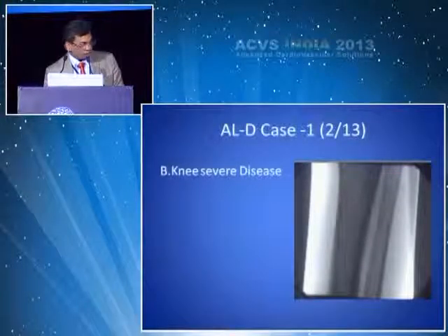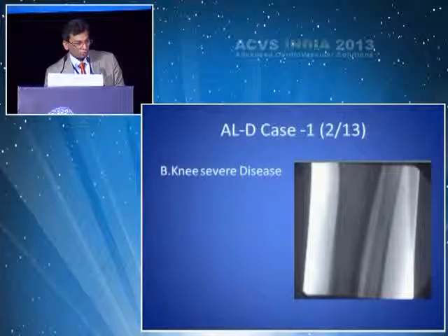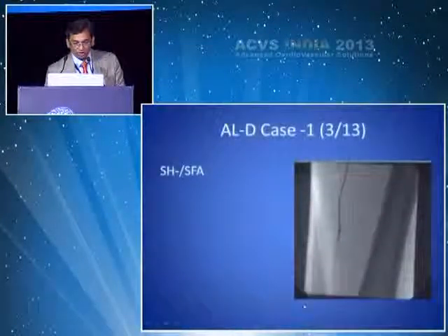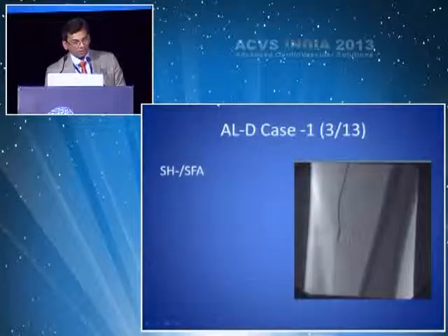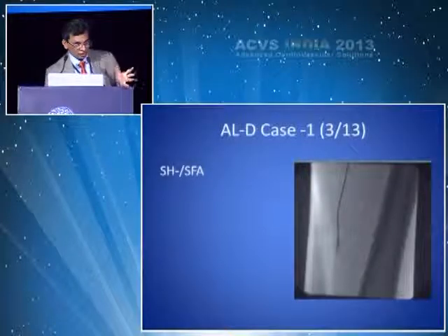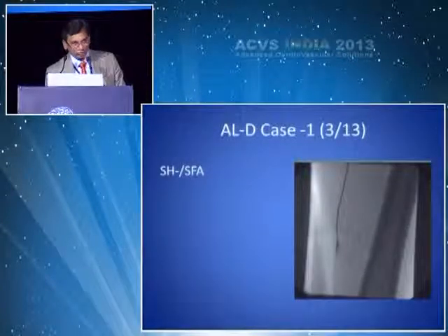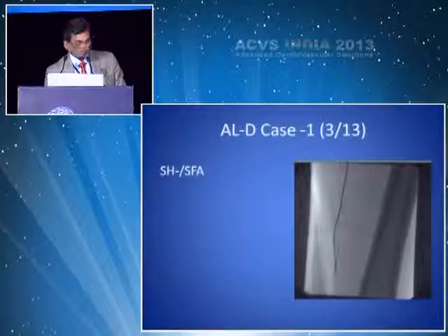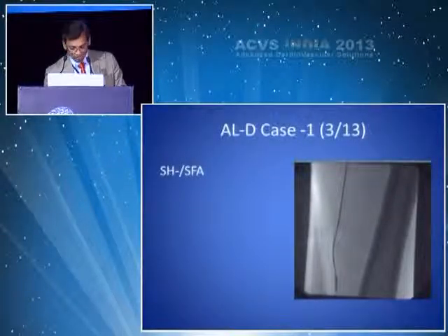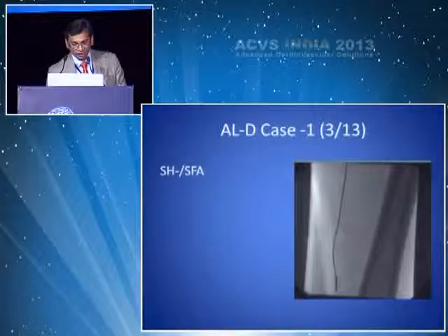One aspect of below knee, these are small vessels, diffusely diseased, particularly in diabetics. The important thing to remember is stenting and ballooning in peripheral vascular disease is extensively done across the board. These are not like coronary arteries. I believe peripheral vascular disease should be managed with debulking as much as possible and also manage the thrombus. This is a case example to demonstrate that.